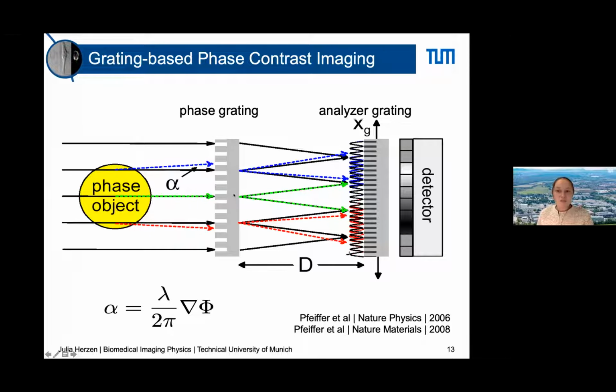So you would have to use a very highly resolving detector, and then your field of view will be really limited. But if you want to scan a full mouse or even patients, so humans, then you need to be more independent from the detector size or the resolution. So you take a standardly used clinical flat panel here with 150 to 300 microns resolution.